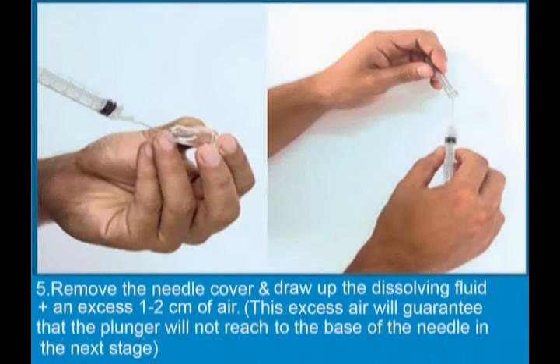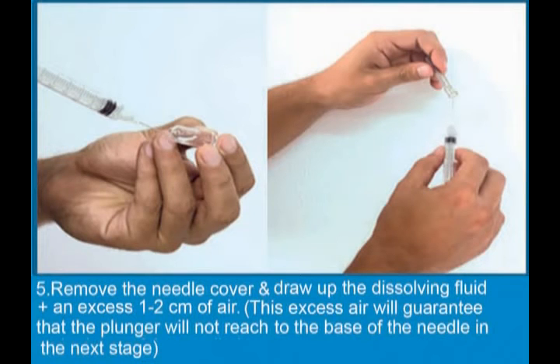Remove the needle cover and draw up the dissolving fluid and excess of 1-2 cm of air. This excess air will guarantee that the plunger will not reach to the base of the needle in the next stage.